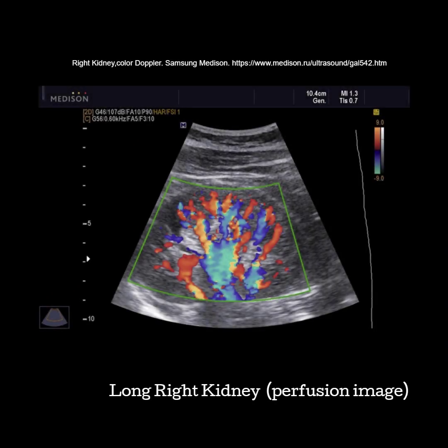The last image in long is a perfusion image. Make sure that the color box is open to cover the entire kidney. Turn your color gain up and PRF down to make the machine more sensitive to flow in the veins and smaller peripheral arteries. The transducer is angled through the mid and medial portion. This image should show the renal artery and vein and evidence of flow into the cortex.